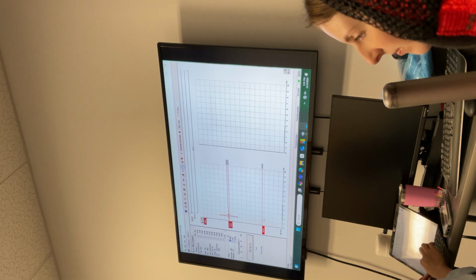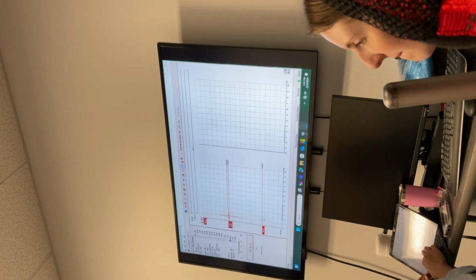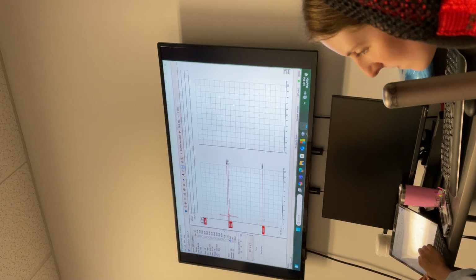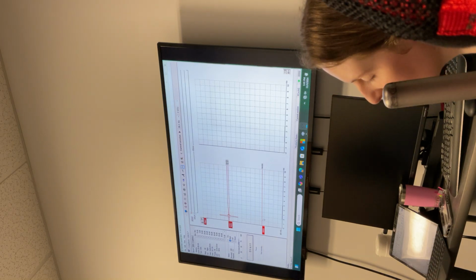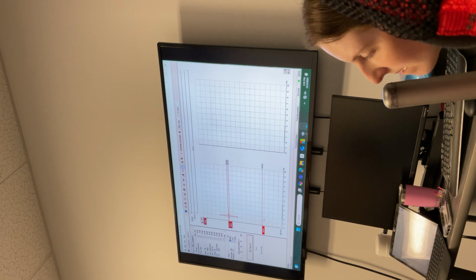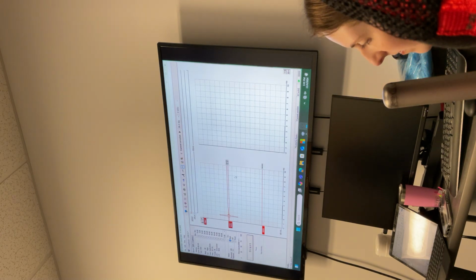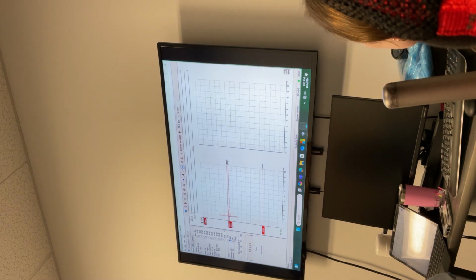So with insert, it's not that big a deal because there's a 0.9 millisecond delay. You don't see that stimulus artifact. If you start your waveform from zero, you don't see what's going on before zero. The stimulus artifact is a problem around that 0.9 millisecond. You can see it in the response waveform at high intensity.